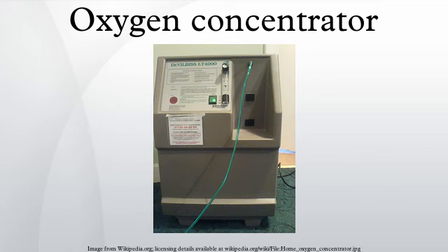How oxygen concentrators work. Oxygen concentrators operate on the principle of rapid pressure swing adsorption of atmospheric nitrogen onto zeolite minerals and then venting the nitrogen. This type of adsorption system is therefore functionally a nitrogen scrubber, leaving the other atmospheric gases to pass through. This leaves oxygen as the primary gas remaining. PSA technology is a reliable and economical technique for small to mid-scale oxygen generation, with cryogenic separation more suitable at higher volumes and external delivery generally more suitable for small volumes.